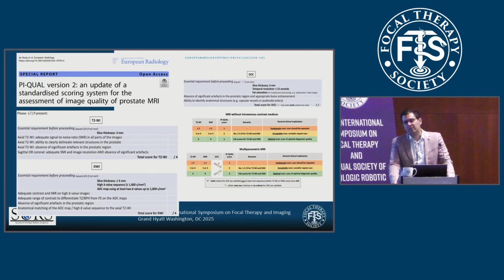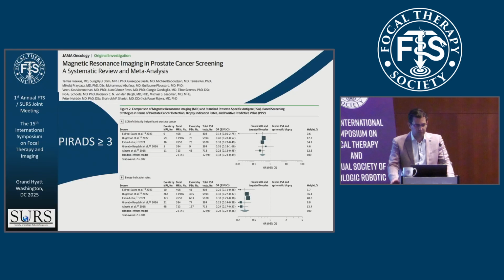I do not think every scan you do has to be PI-QUAL graded. I think it takes too much time. But all of your centers that do it should be PI-QUAL compliant. And I think what's really important is that we're talking about quality today for interpretation.